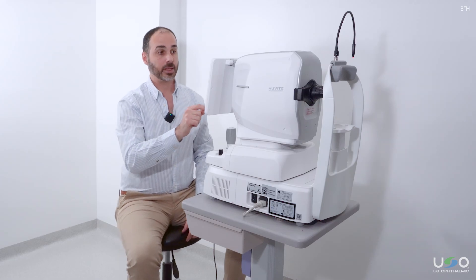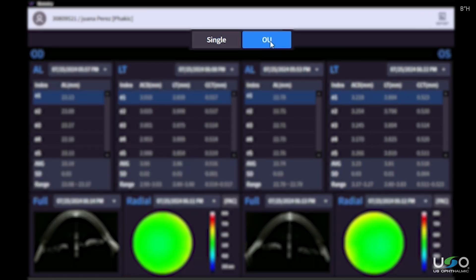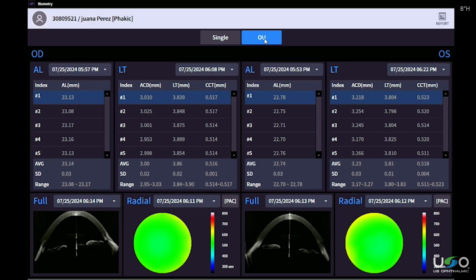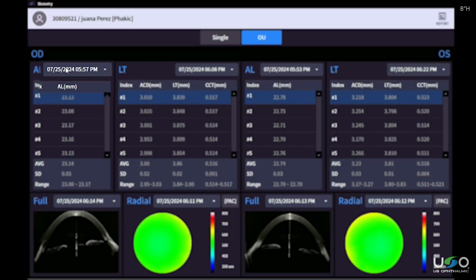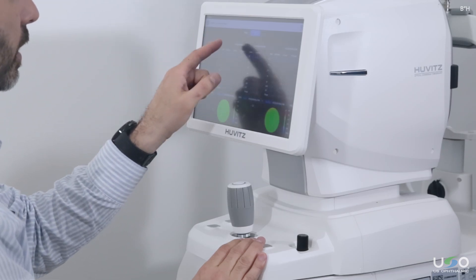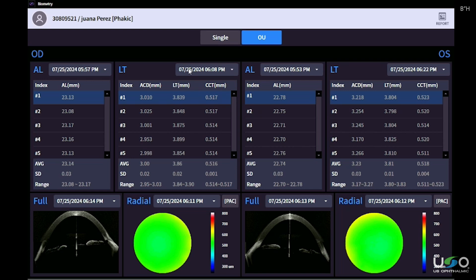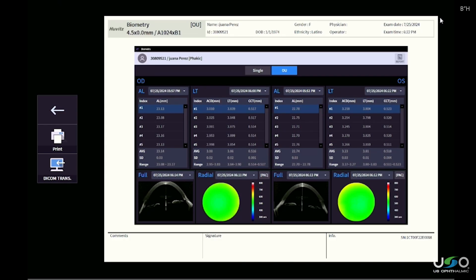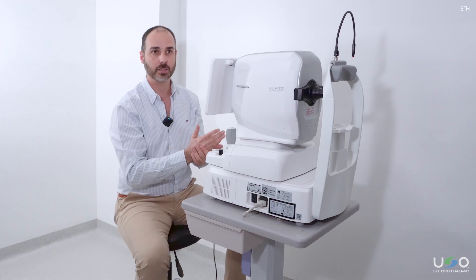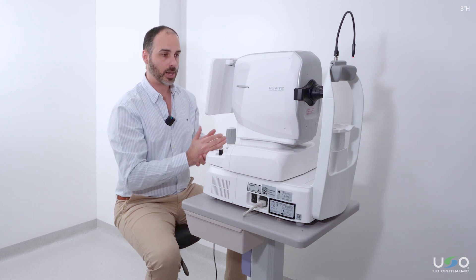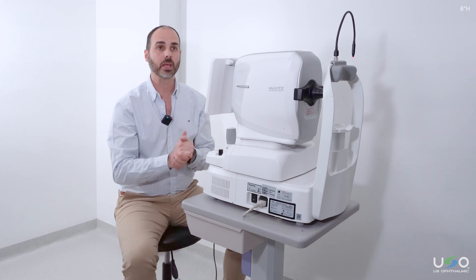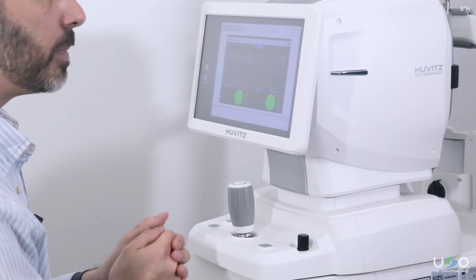We can also visualize both eyes simultaneously. In the upper left, we can choose the date and time of each study for each eye, and for axial length and lens thickness. As we can see, we have all the information from both eyes to generate a report quickly, and we always have the option to print via USB or network, or save the file as a PDF to any network location or USB storage media.